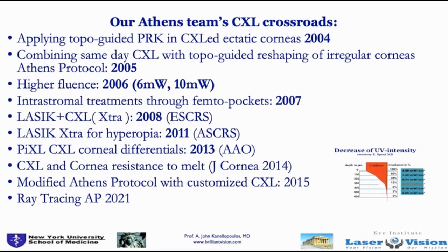You could, but the femto locks on the cornea, and when it locks, if you've done a SMILE procedure, it moves the cornea as it locks it in a little bit. So how do you know if it's rotated 2 degrees or 5, or you're on the vertex or off the vertex? SMILE gets away because it creates a much broader flattening zone. So it forgives a lot of error there, and that's its advantage.